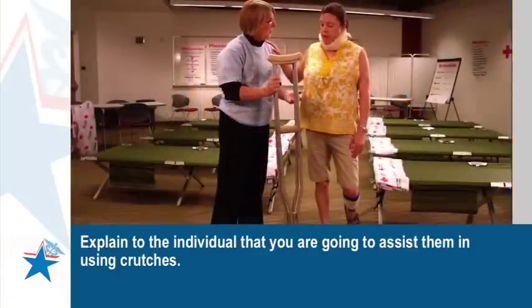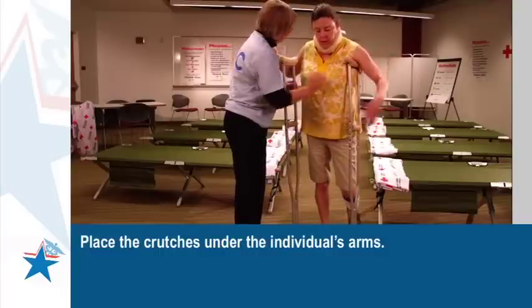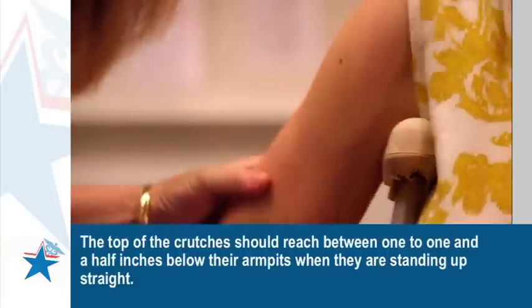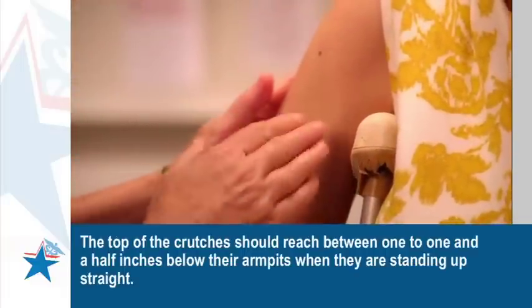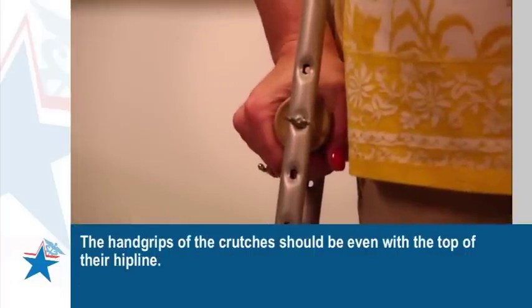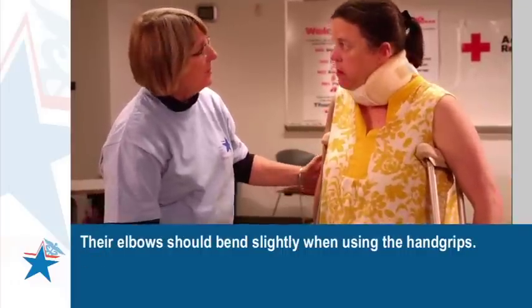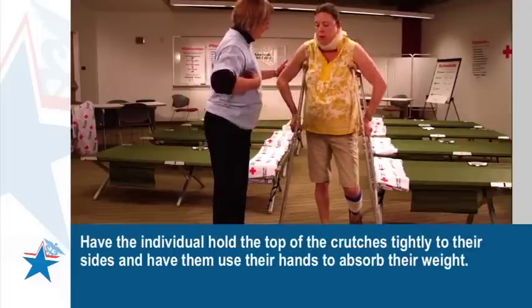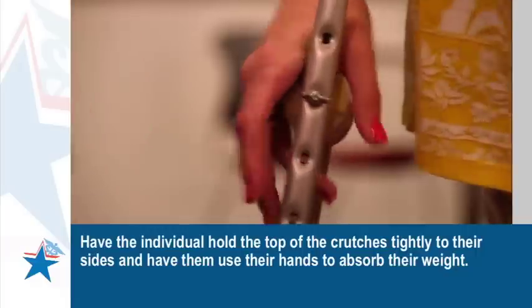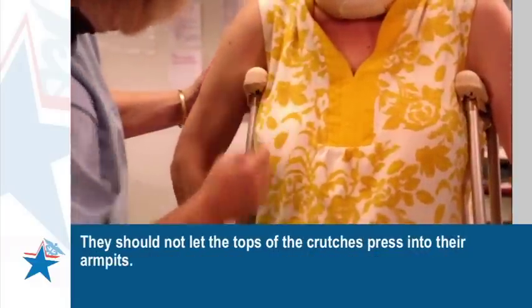Explain to the individual that you are going to assist them in using crutches. Place the crutches under the individual's arms. The top of the crutches should reach between one to one and a half inches below their armpits when they are standing up straight. The hand grips of the crutches should be even with the top of their hip line. Their elbows should bend slightly when using the hand grips. Have the individual hold the top of the crutches tightly to their sides and use their hands to absorb their weight. They should not let the tops of the crutches press into their armpits.